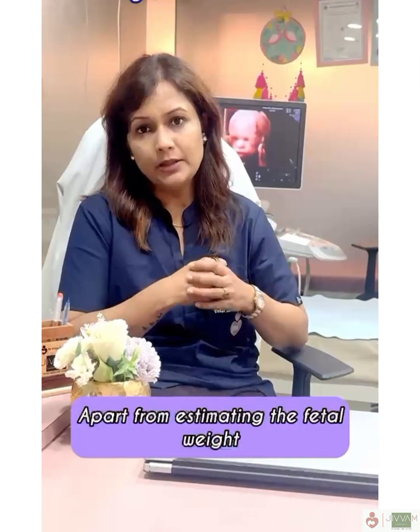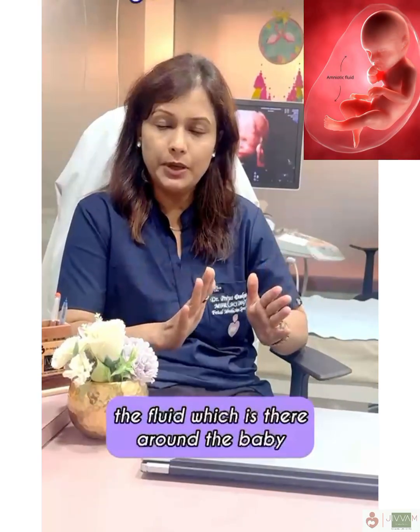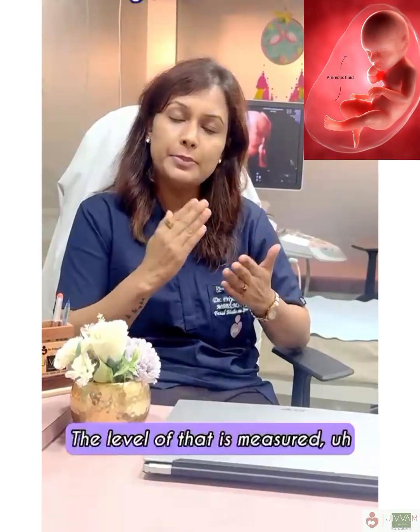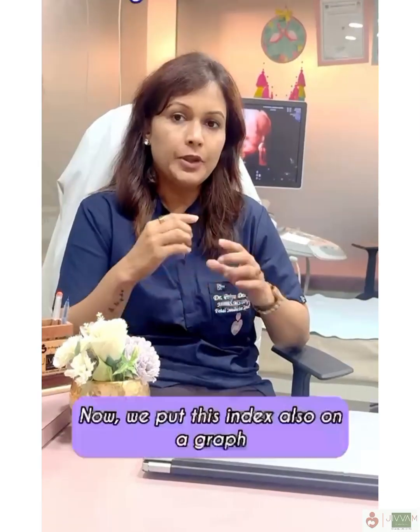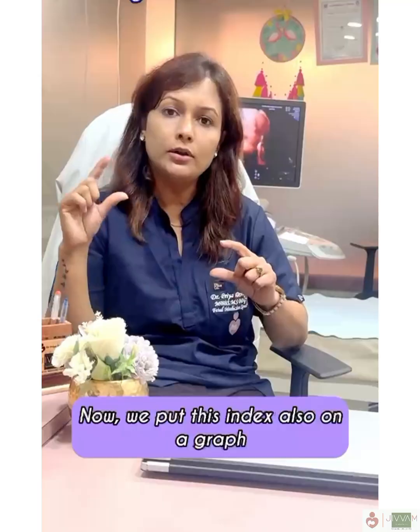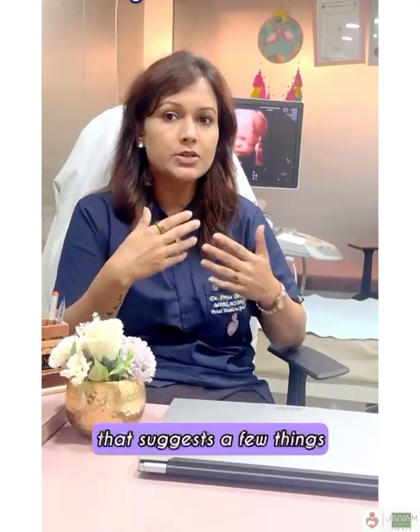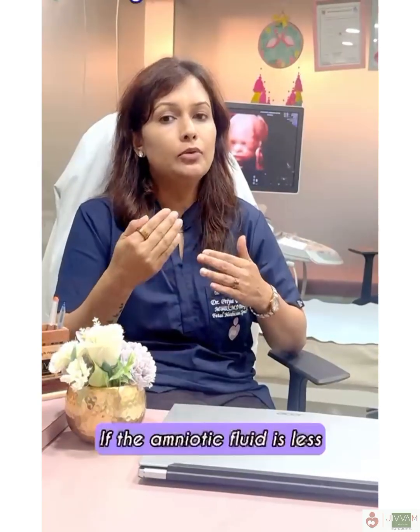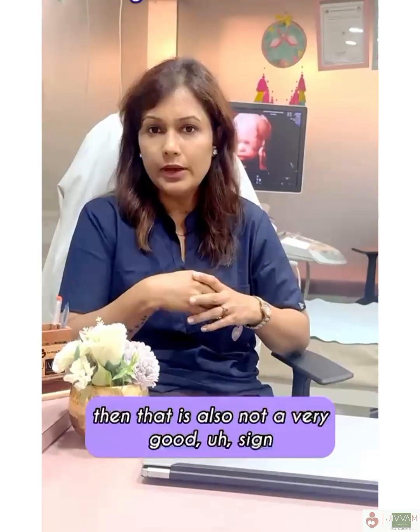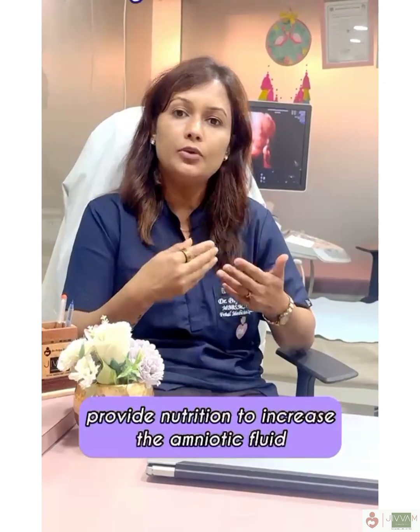Apart from estimating the fetal weight, we also check the amniotic fluid, the fluid which is there around the baby. The level of that is measured as the amniotic fluid index. Now we put this index also on a graph. If it is normal, it's good. If it is more, then that suggests a few things, and then we have to investigate further. If the amniotic fluid is less, then that is also not a very good sign, and then we have to take some measures to provide nutrition to increase the amniotic fluid.